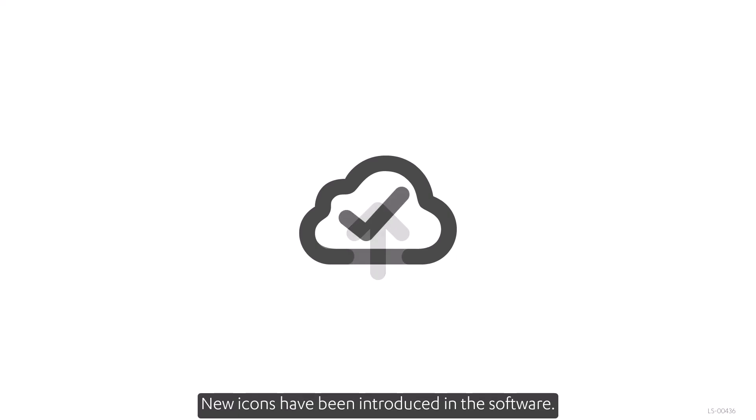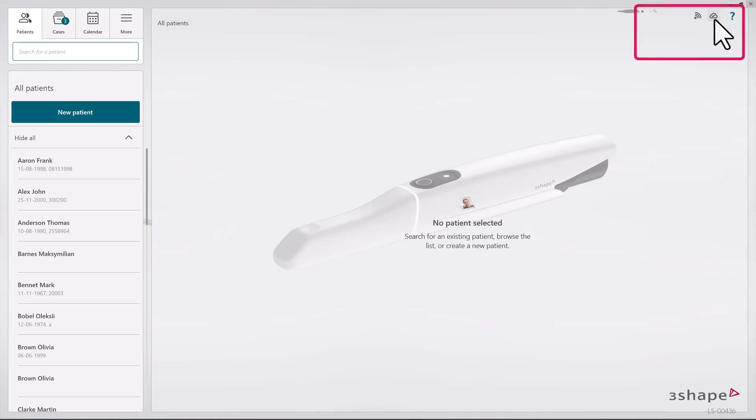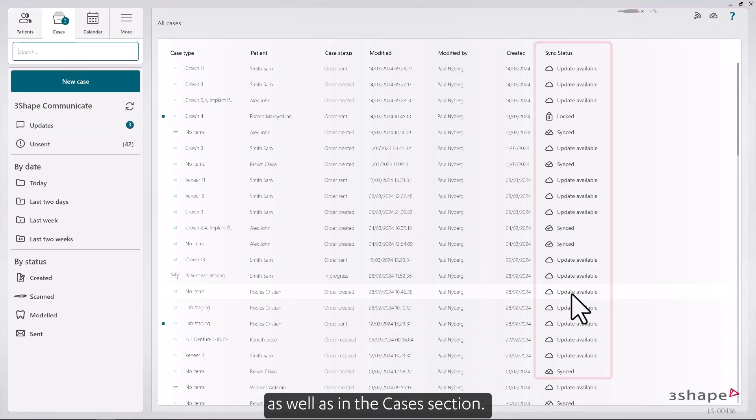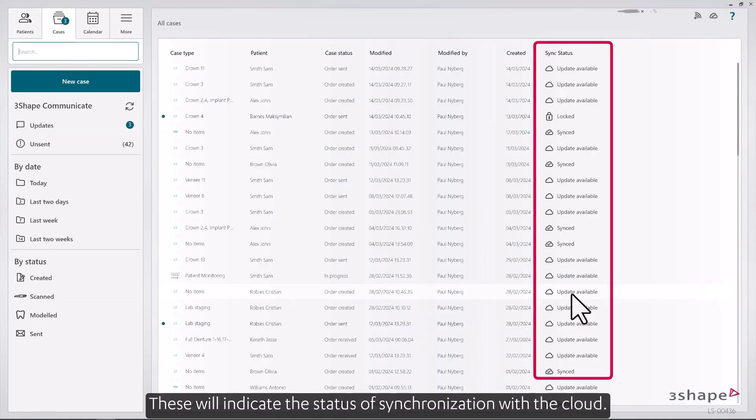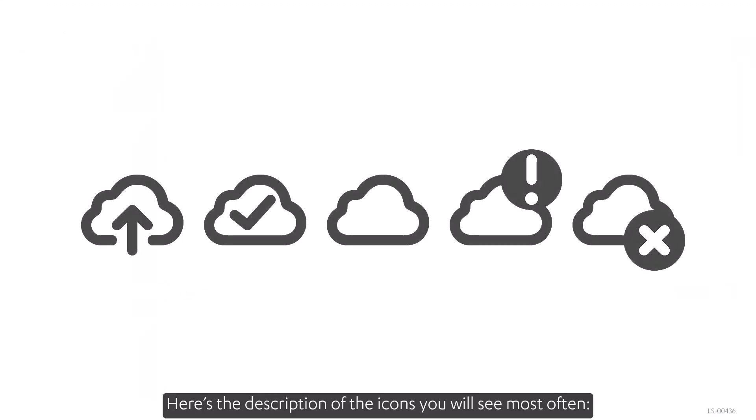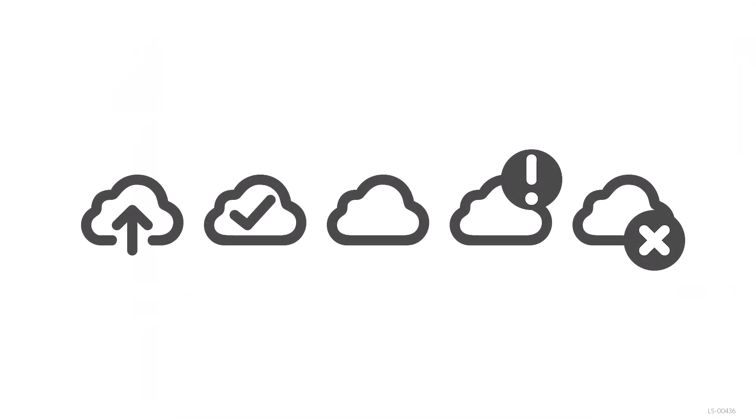New icons have been introduced in the software. You'll see them on the main page as well as in the Cases section. These will indicate the status of synchronization with the cloud. Here's a description of the icons you'll see most often.